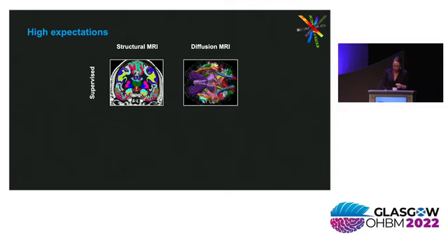So far, we have talked about supervised tractography, where we know what tracks we want to reconstruct, and we train an algorithm to do that. If this was structural MRI, we would be done. We could declare victory and go straight to club night. Because that's what we do when we segment MRI data. We know that there's a thalamus, an amygdala, et cetera, et cetera.